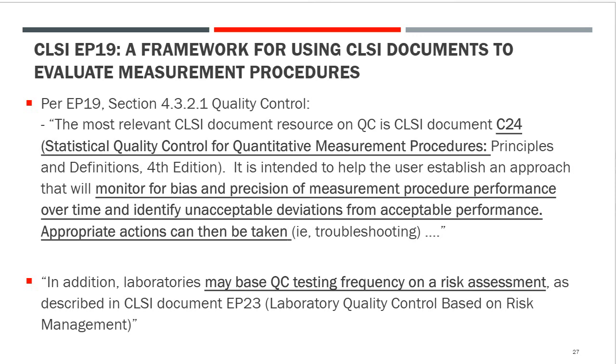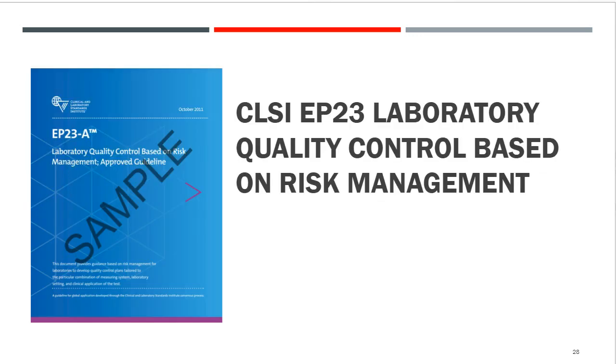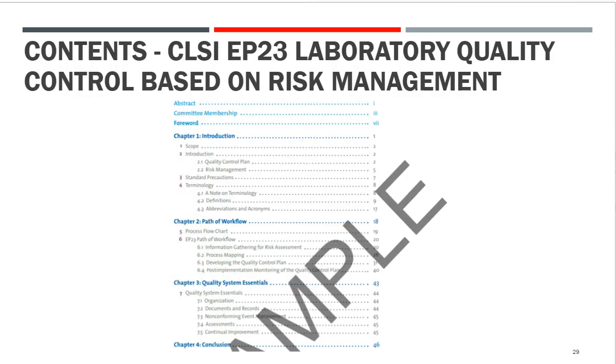In addition, laboratories may base QC testing frequency on risk assessment, as described in CLSI document EP23, Laboratory Quality Control based on risk management. Okay, let's do that. CLSI EP23, Laboratory Quality Control based on risk management. This is the table of contents, and we can look at some of the sections of what does it cover, and we're going to spend a little time with these.